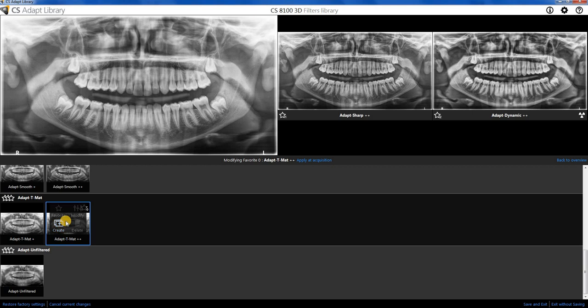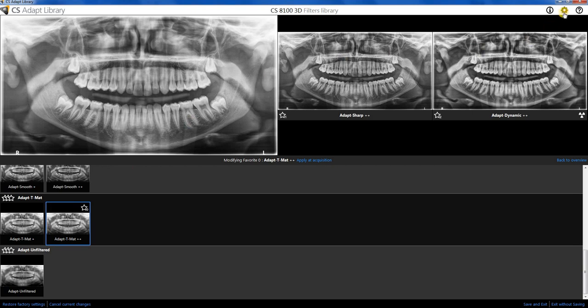We can also further customize those if we want to. We won't go over that today, but if you'd like to play around with it, you're welcome to do that.